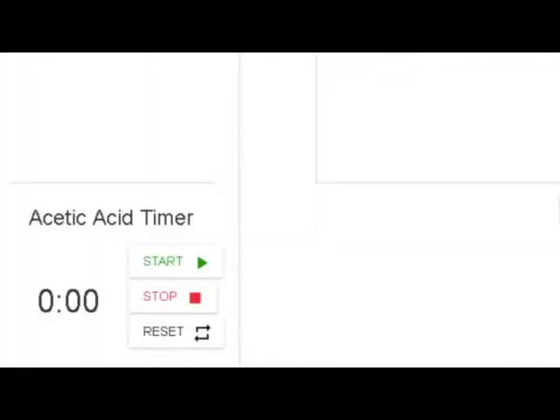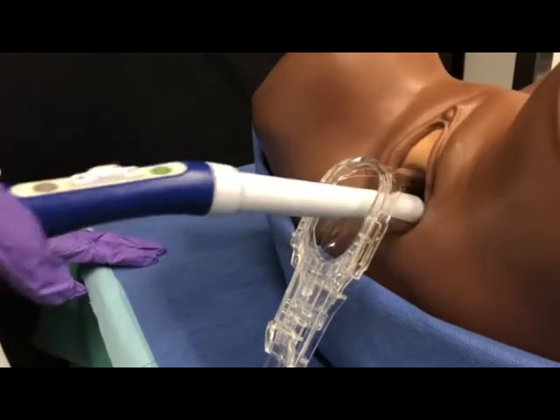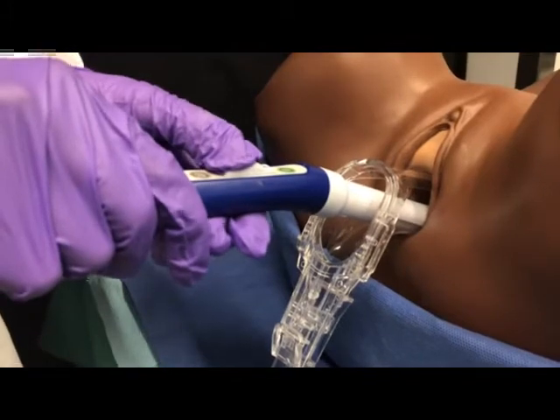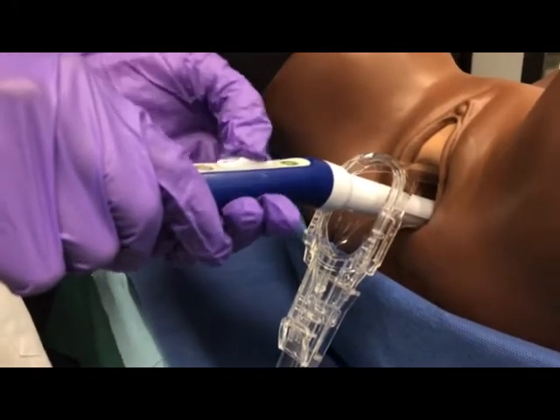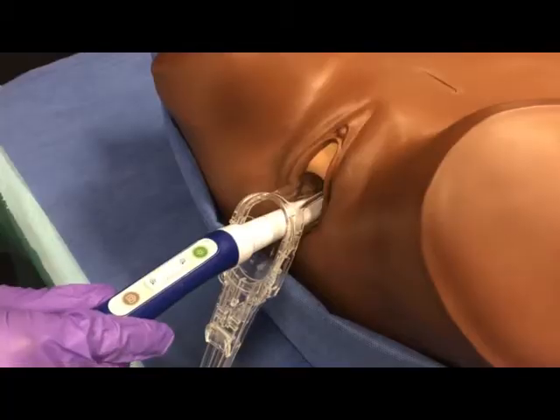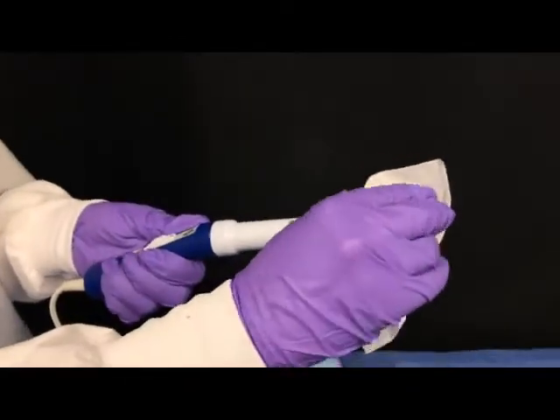If clinical protocol requires timed use of acetic acid, press the start button immediately after acetic acid application. To stop the timer, press the stop button. To reset the timer back to zero, press the reset button. Insert the probe. Slide the probe tip through the speculum, aligning the handle control strip to the 12 o'clock orientation. Use the live video to avoid touching the vaginal walls or cervix with the probe. If the tip contacts tissue or if the image appears hazy or foggy, remove the probe and gently wipe clean with a sterile cloth or swab before reinsertion.